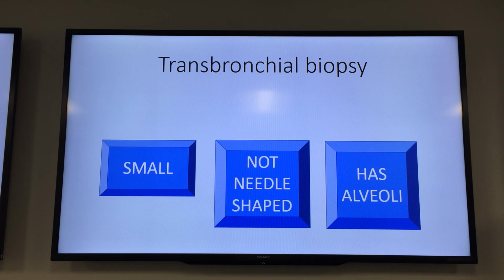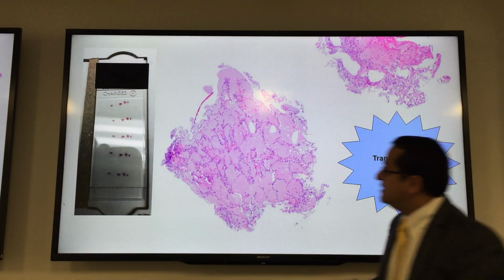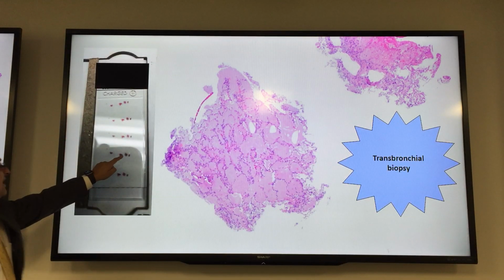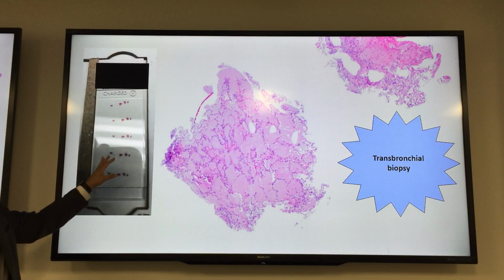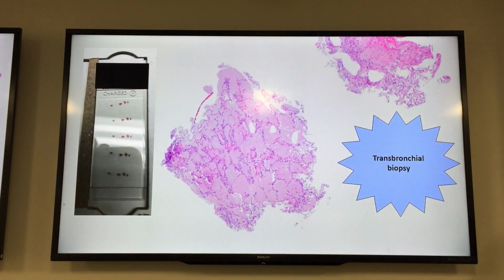And that's what you'll see. So Narendra, you're starting today, you'll see all those three, and I'll ask you once during sign-out what kind of biopsy you see, okay? So it'll be a test. So that's the answer. And when I say small, I mean small like this. Really tiny fragments, and you should be able to tell just by looking at it, but we are dealing with a small biopsy of the lung. And then that's the correct answer.